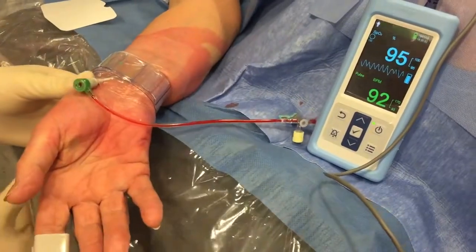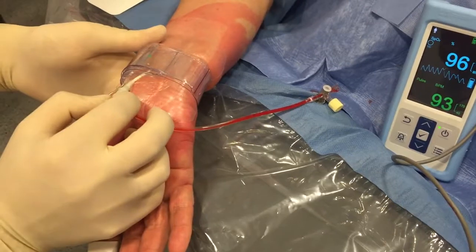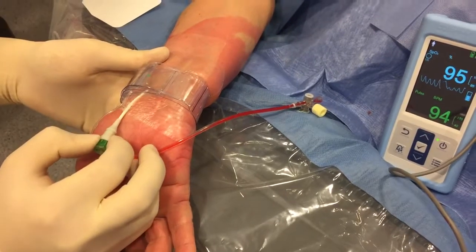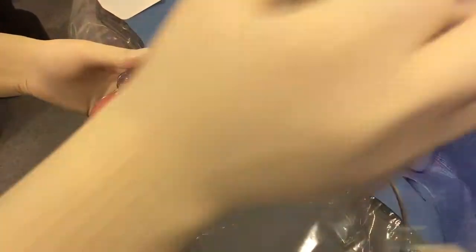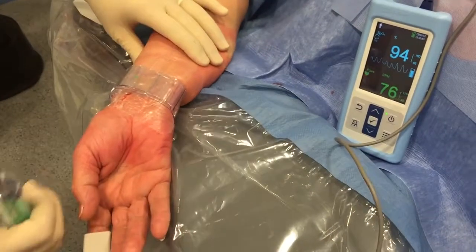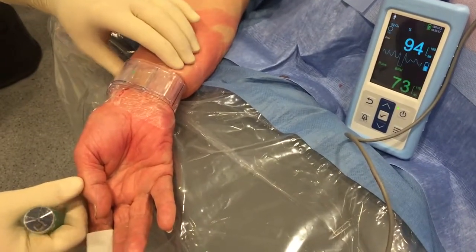Then we remove the introducer and check if there is any bleeding. You see here that the removal is very smooth and without pain, so there are no spasms in the radial artery. Now we have a pulse on the plethysmograph, but it's impossible to state if we have an occlusive compression of the radial artery.